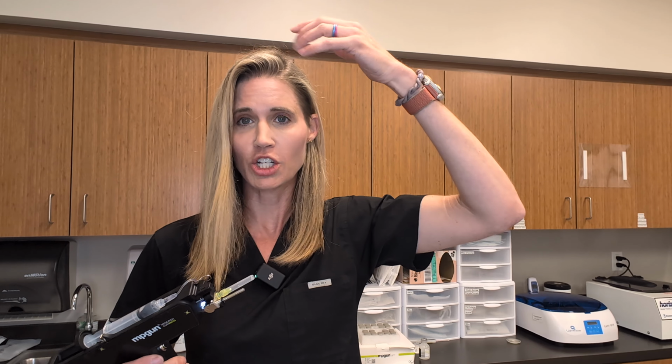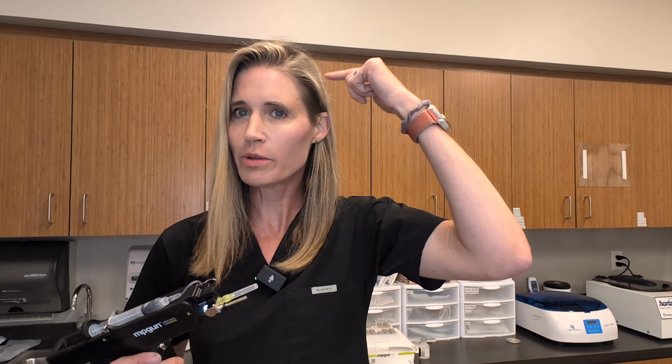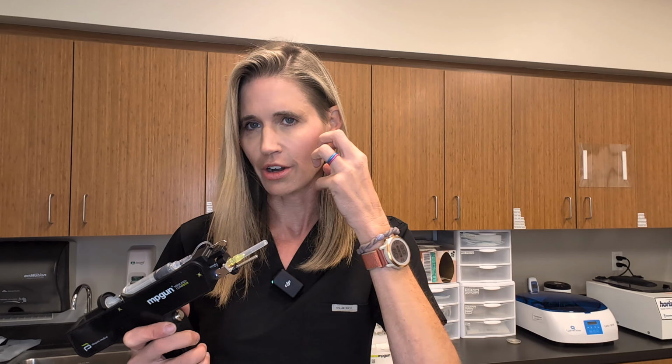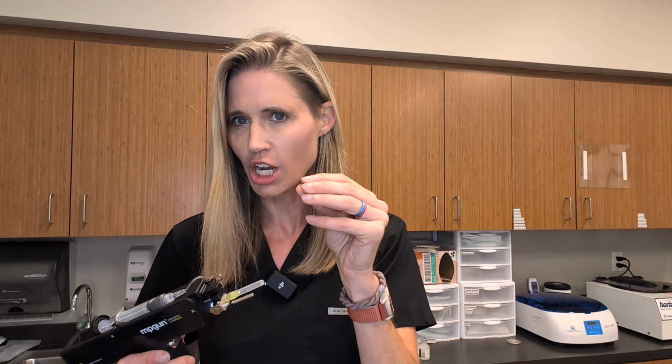Change your needle kit when you change body areas to keep the needle sharp and reduce the pain. So for example, if you're doing a scalp on a patient and also doing her face, you want to change the needles in between those in most cases. It is not necessary to change the needle kits if you're just doing a small area of the scalp and a small area of the face. It's really about how many injections you can get out of that needle before eventually it becomes a little bit more dull.